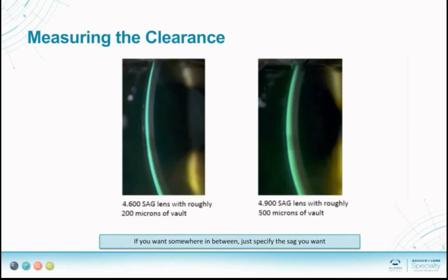To simplify the starting point for clearance with Zen Lens, aim for an initial clearance of 350 microns, or a 1-to-1 relationship of the clearance to the center thickness. Having 350 microns initially builds in extra clearance for settling. You can always adjust more or less after you see the patient when the lens has fully settled.